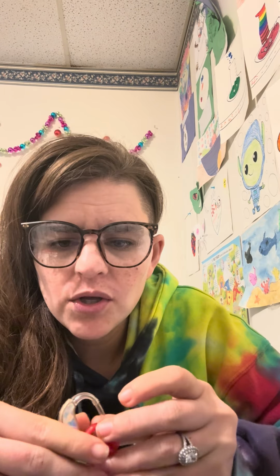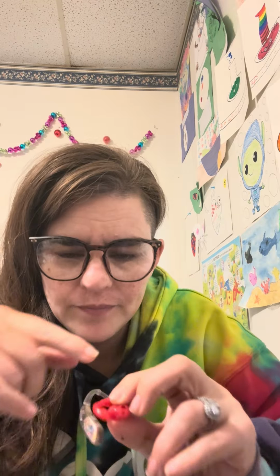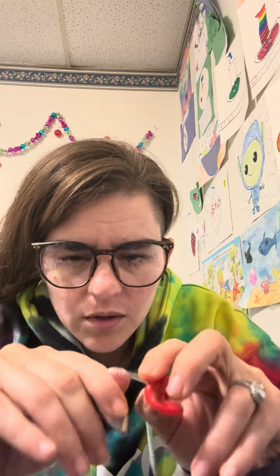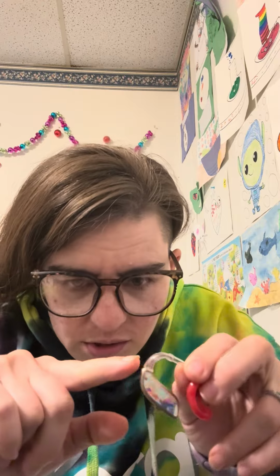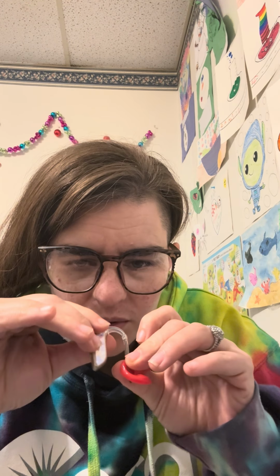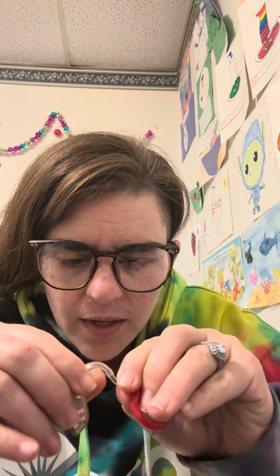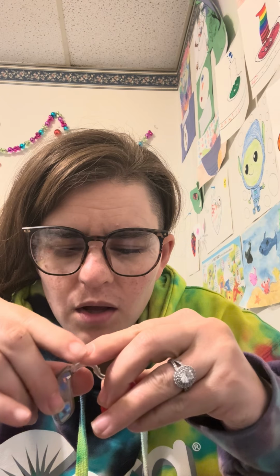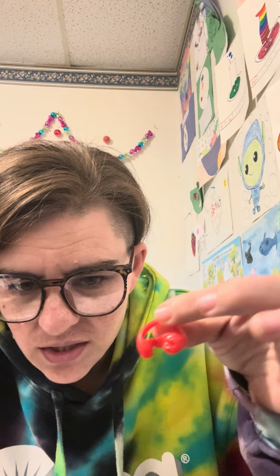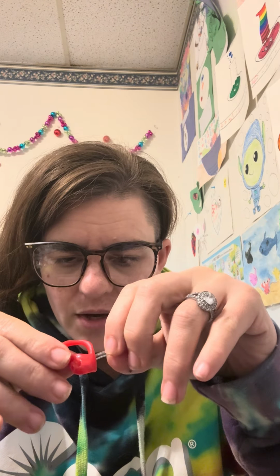Anyway, so the way you know you need to change your tubing is it's really hard up here and inside the mold area. So you're going to pull it off the tubing, off this hook. This is called a hook. This is if you have BTE hearing aids, which stands for behind the ear, which is this style with the changeable tubing. So you're going to pull it off the hook. Mine is really hard to pull off because it's so hard right now. But you pull that off, and then it's still connected to the mold. And then you can just pull it out of the mold.